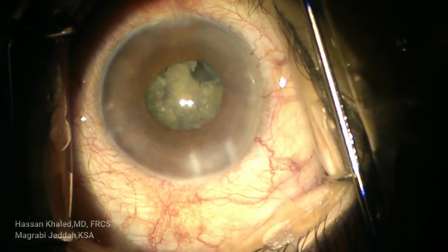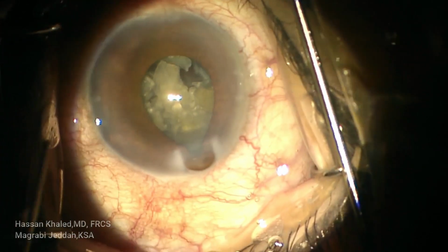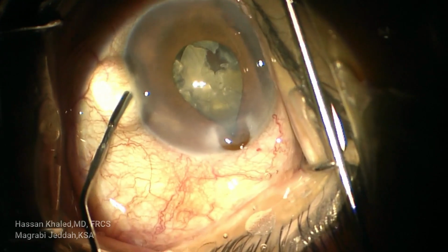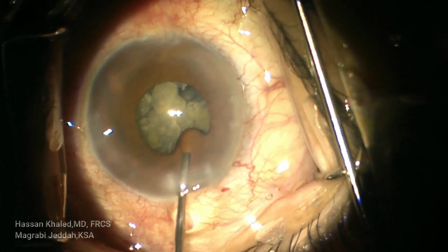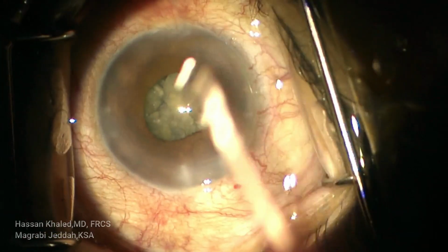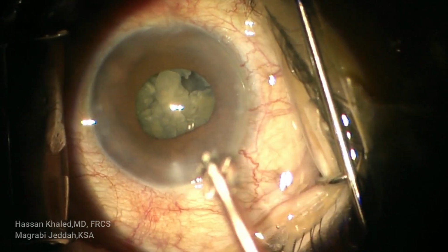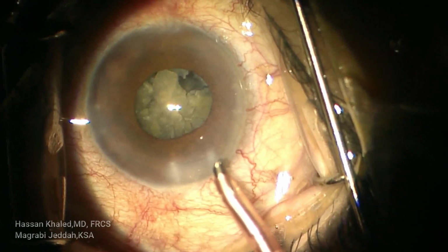While removing this dense cataract through this pupil, you can do viscodilatation many times by injecting the OVD, the dispersive one, which can also protect the endothelium of the cornea while removing this dense cataract.